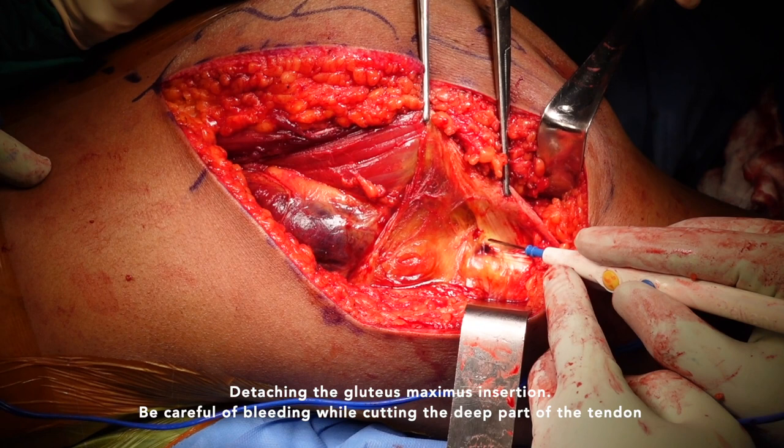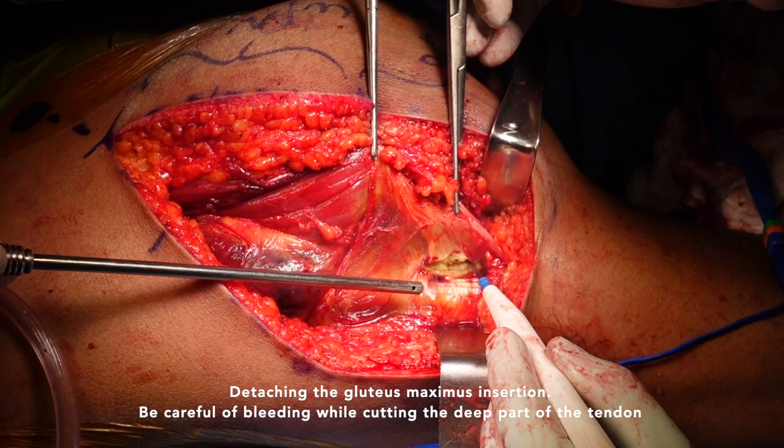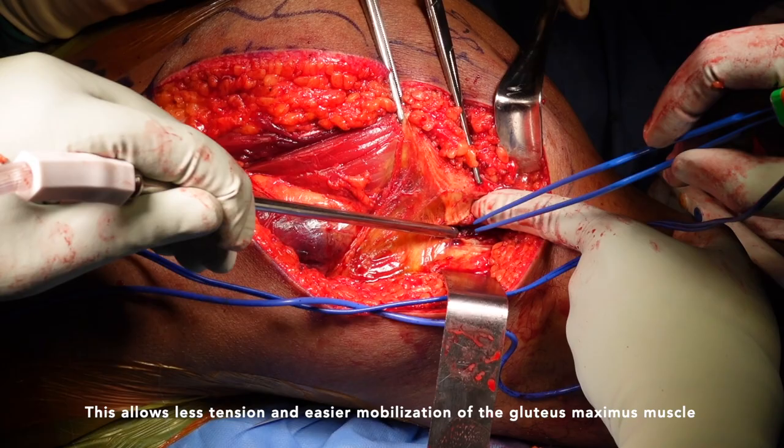Detach the gluteus maximus insertion. Be careful of bleeding while cutting the deep part of the tendon. This allows less tension and easier mobilization of the gluteus maximus muscle. Cut the trochanteric bursa and blunt dissect using a finger.